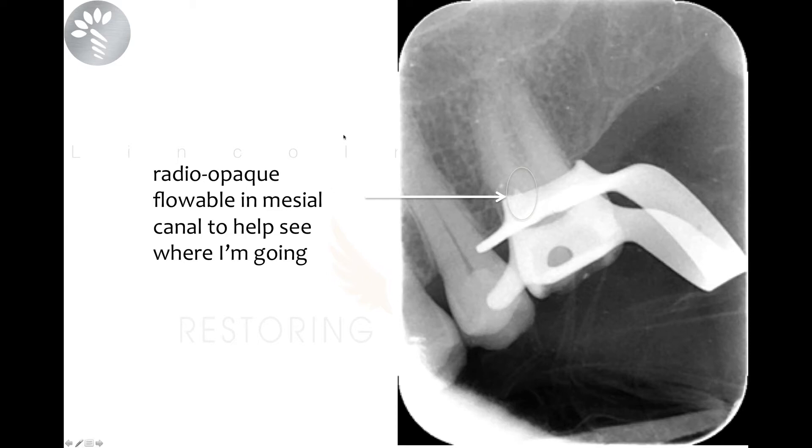Looking at this radiograph, you can tell it's going to be difficult to find the canals. Sometimes when you can't find canals, if you trough far enough up the root, you will eventually find them. The trouble of course is that it's easy to go off track one way or the other.